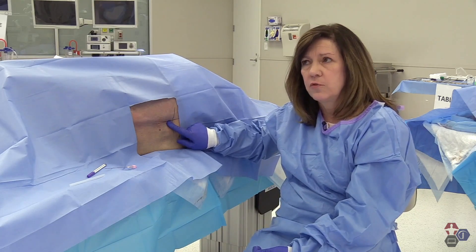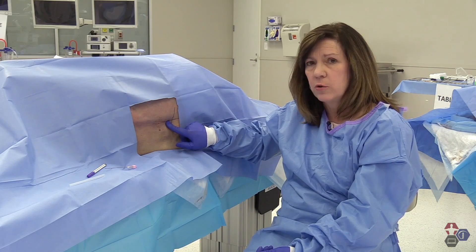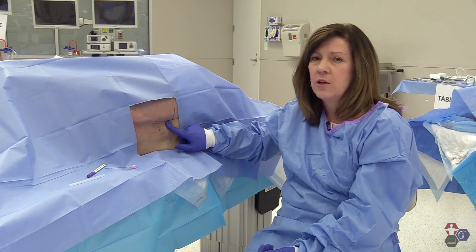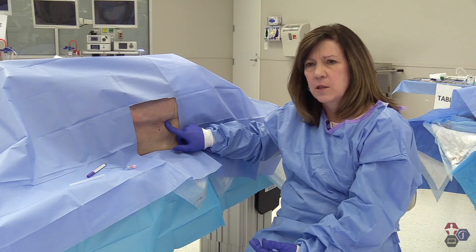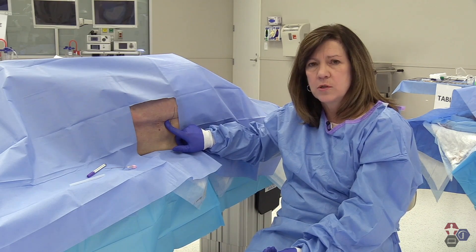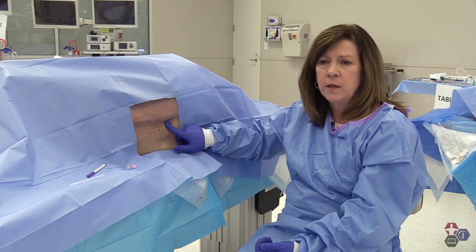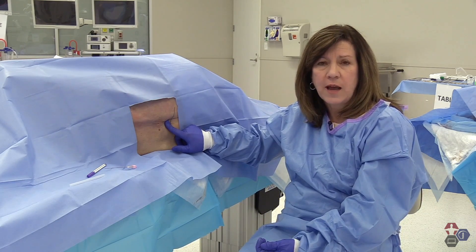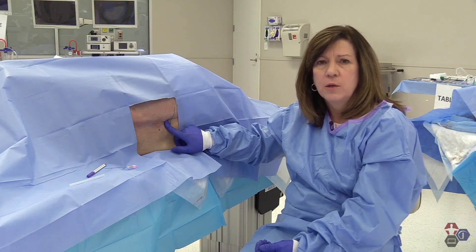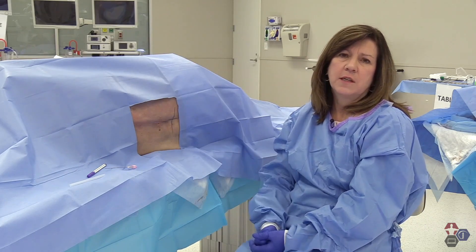The risks of a lateral approach are no different than the risks with a midline approach. In my practice I've found a higher yield of successful lumbar punctures with this technique, and it might save you an agonizing phone call. Post-procedure patient care is the same — have them lie on their back for an hour, which potentially reduces the risk of a dural rent, bleeding, or leaking of cerebral spinal fluid that could result in a post-spinal tap headache. Always check neurologic function after the procedure. Throw your sharps away, clean up your area, and document a good procedure note. Thank you for listening to this presentation on lumbar puncture.